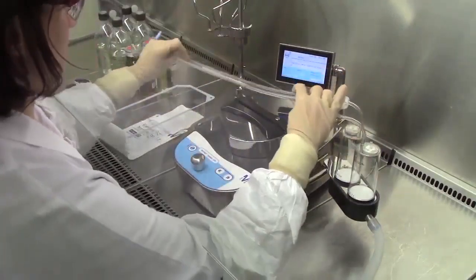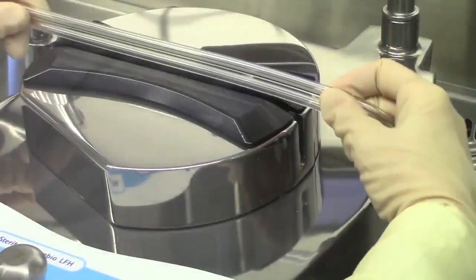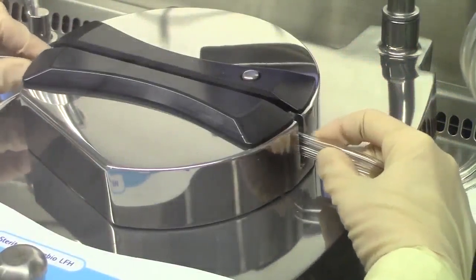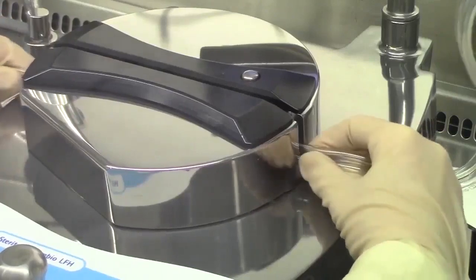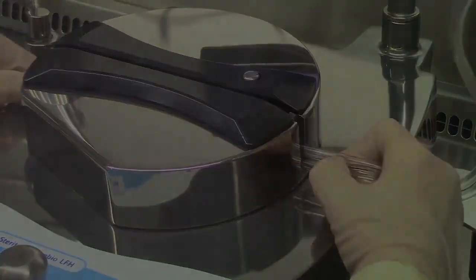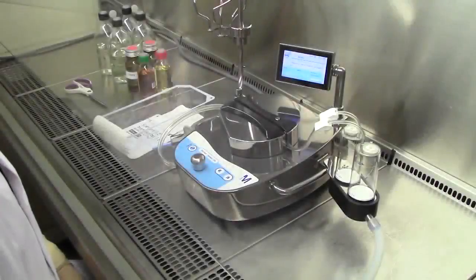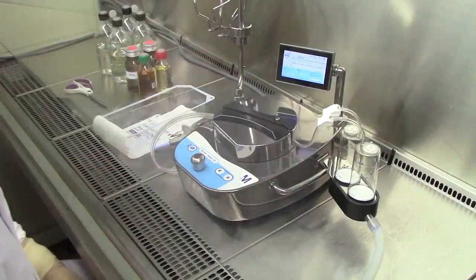Take the tubing straight, push it down in the cover. Make sure the tubing is positioned properly on either side of the tubing guides in the pump head. Slide the tubing from left to right and right to left to ensure that it is correctly positioned. Make sure that the tubing connected to the canister is not under tension. If necessary, slide the tubing to the right in the pump head. Close the pump head by pressing the button.